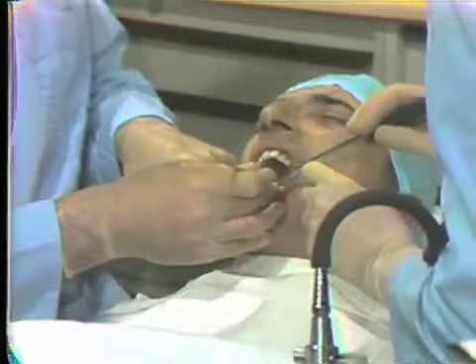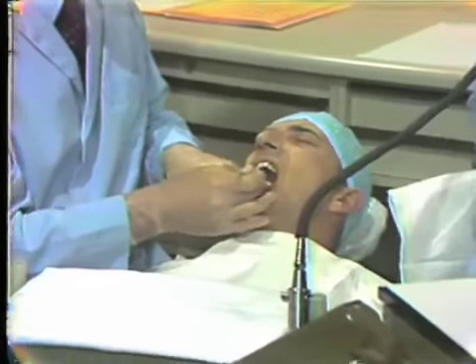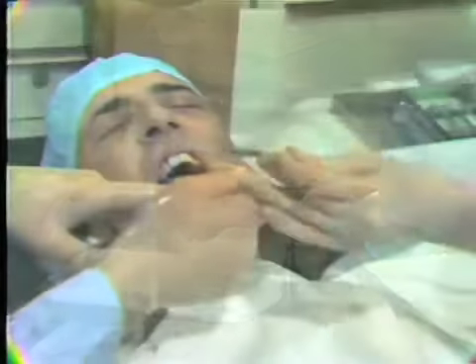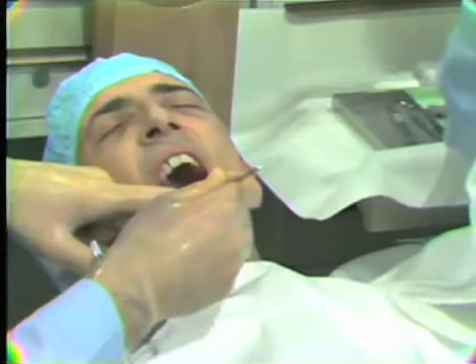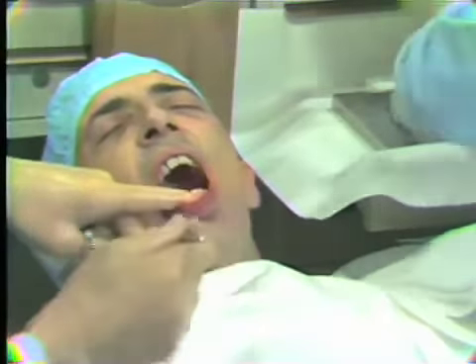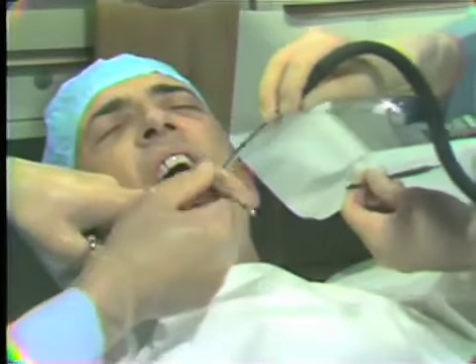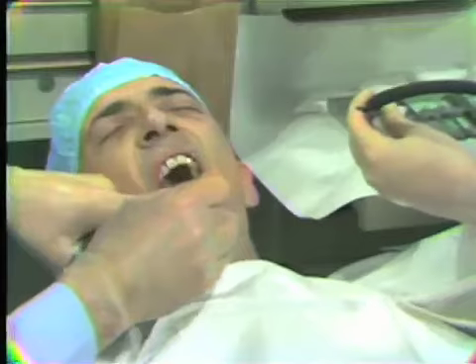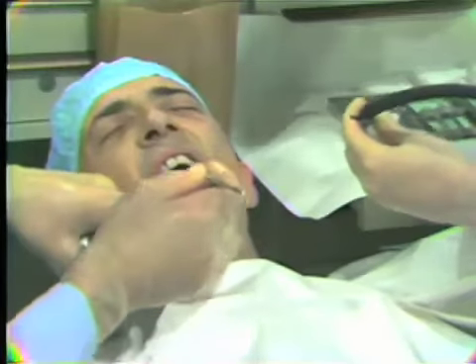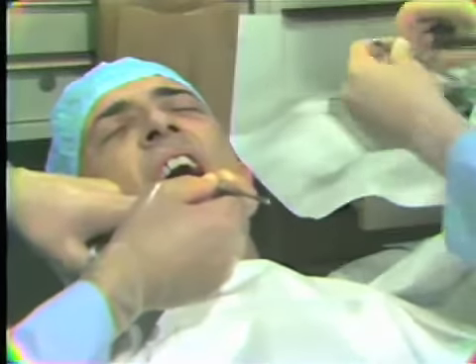Now the number 14 curette, please. In the passage of these instruments, we can stay primarily in the surgical site as the assistant moves in and simply removes the instrument that I have completed the use of from one hand, and we transfer the instrument directly to the other hand and back to the surgical area again. Let us demonstrate this once more, please. May I have the periodontal probe?